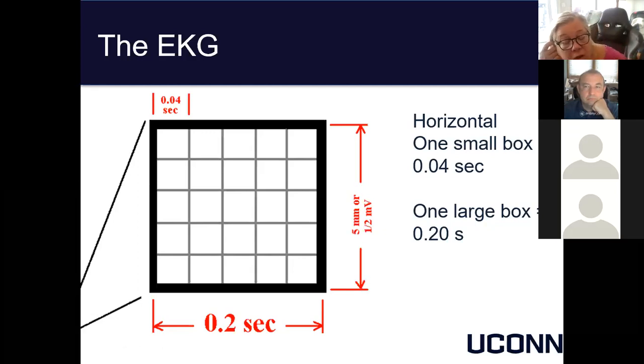If you're going to go into EKGs and work in the EPS lab, the electrophysiology lab, the voltage is going to mean almost as much to you as the timing. But for those of us not in EPS world, there are only a couple of things we look at voltage for.